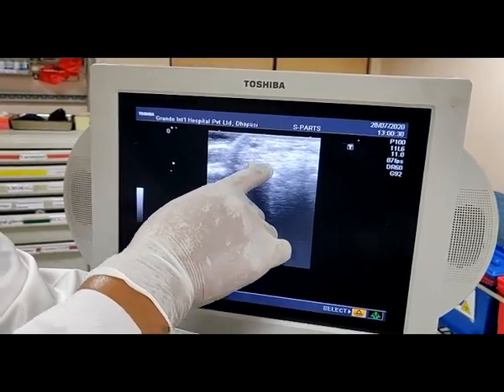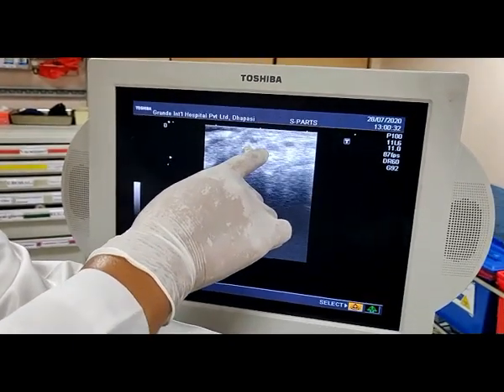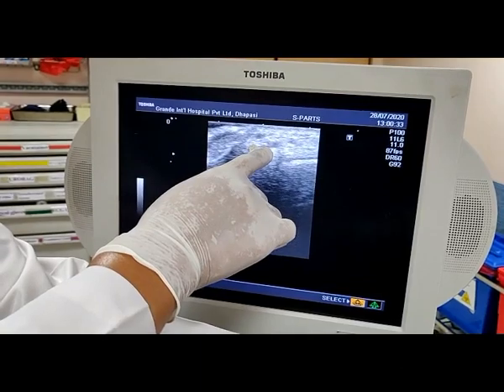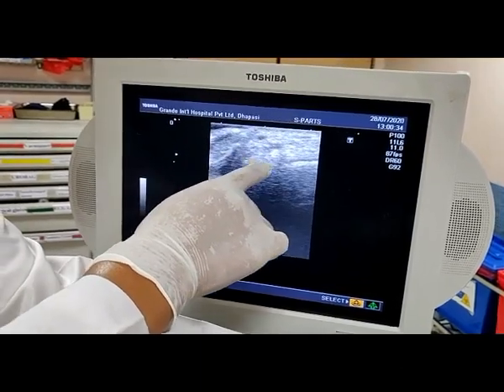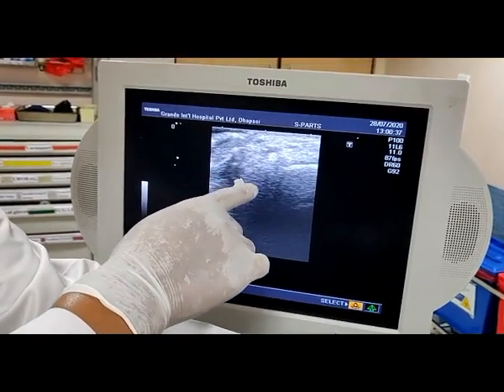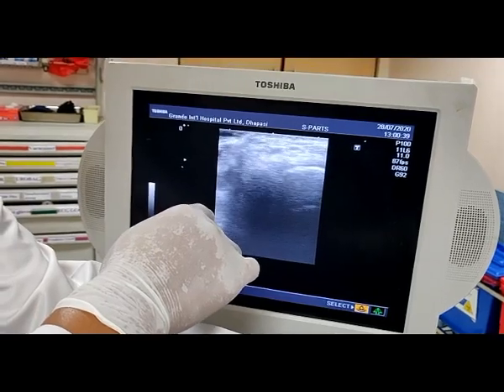If I compress a little bit, all the veins are compressed. The artery is pulsatile and non-compressible — that's how we identify it. This is the transverse view of the radial artery.